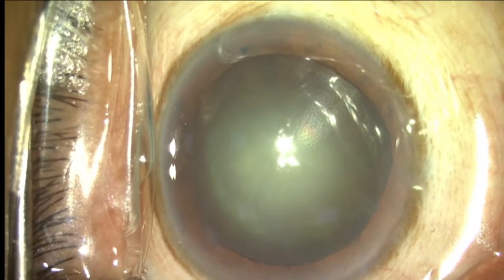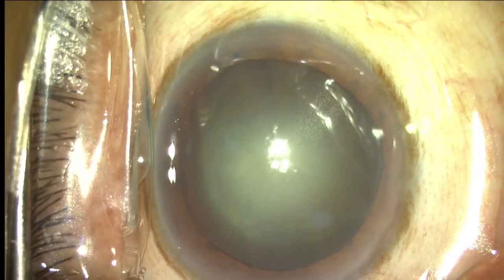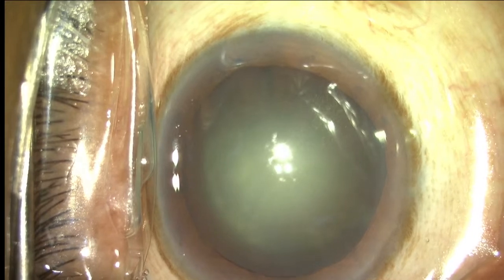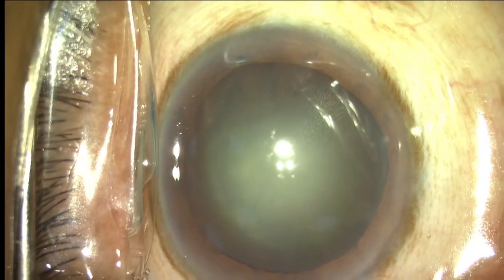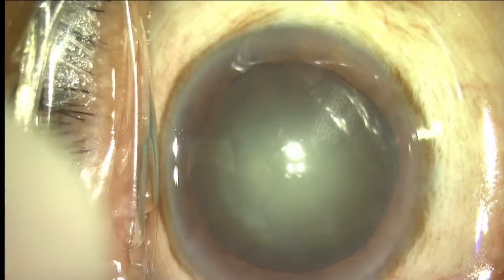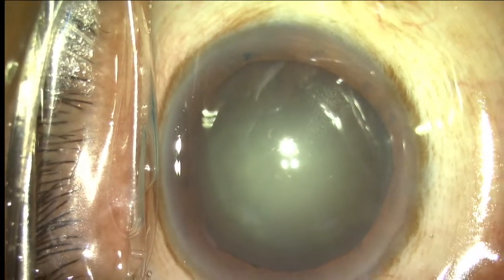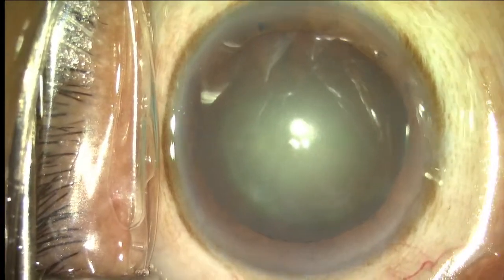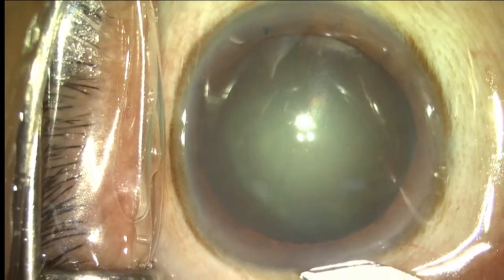Is it clear now? Okay. So my patient today is a 62-year-old male and his IOL power is plus 19.5 diopters, slightly myopic, and his pupil is well dilating and he has no comorbidities. So I'll be starting with the case now. I'll be talking about the lens and its technology as we go along.